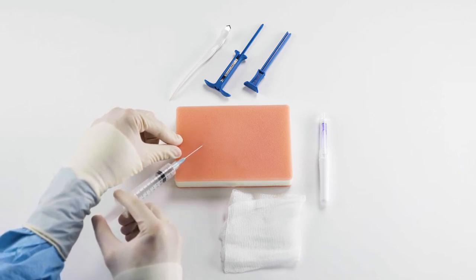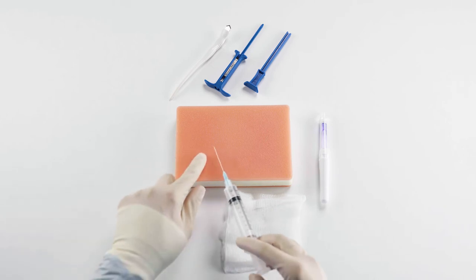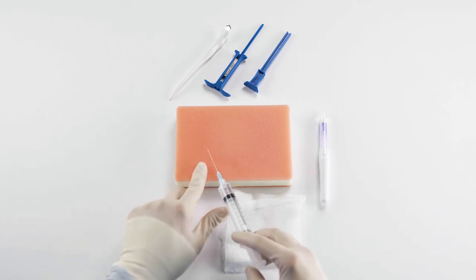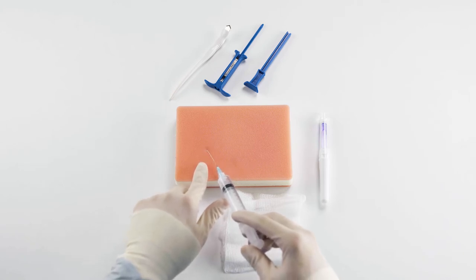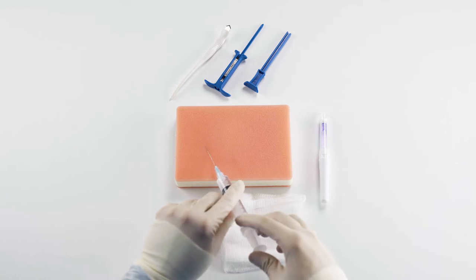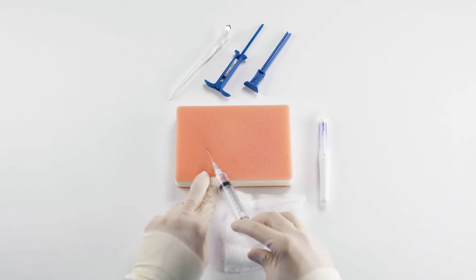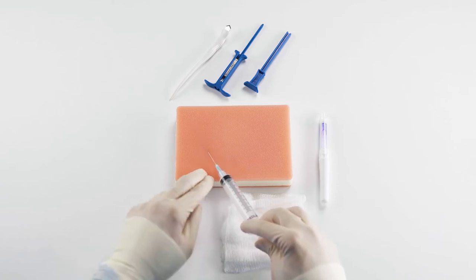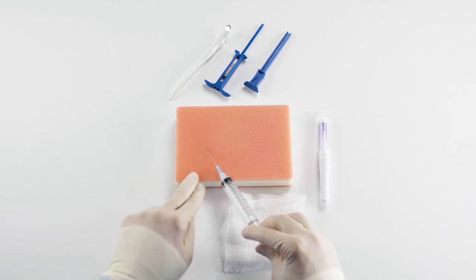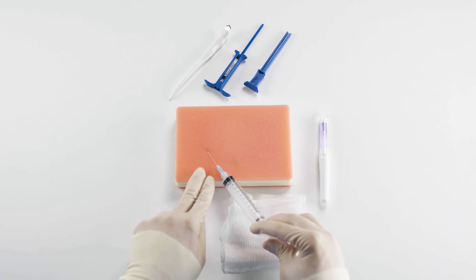I'm going to remove the needle and make another injection to cover where we're going to use the puncture tool. Take a deep breath in and let it out — I'm going to make the puncture, aspirate to make sure we're not in a blood vessel, and inject the remaining lidocaine to cover the incision. The area should be raised because we're keeping this in the subcutaneous space. As you can see, my needle is resting relatively parallel to the surface area of the patient's body.